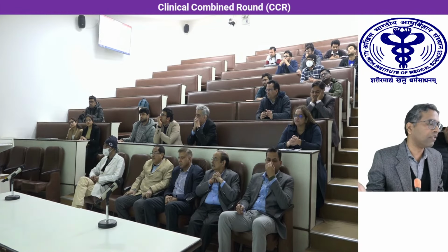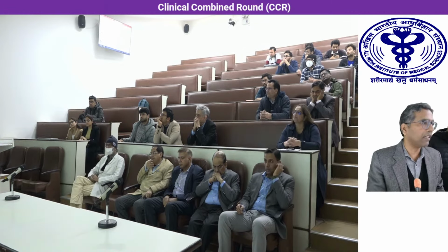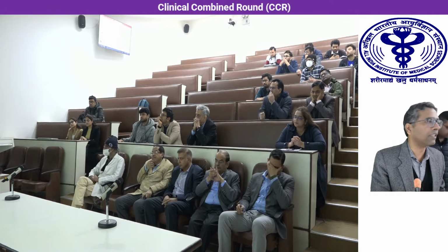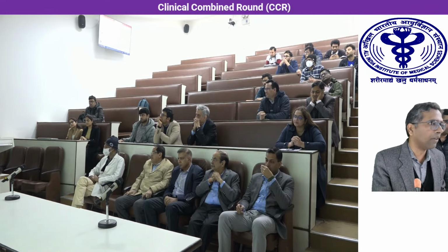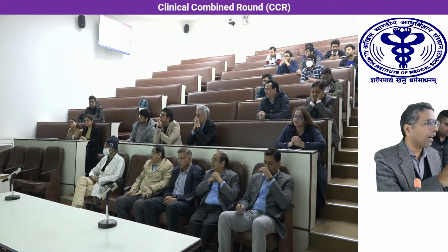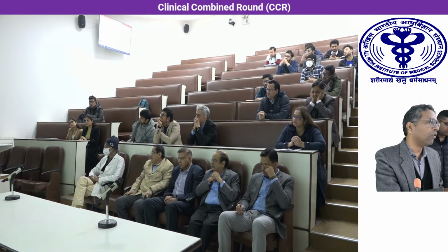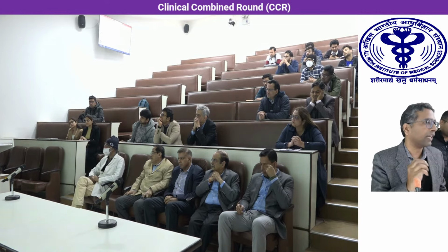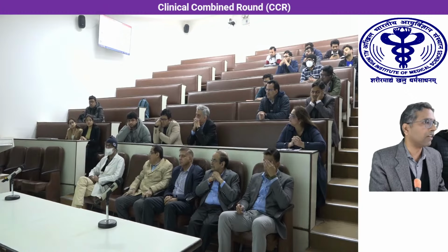If it is a smaller lesion with submucosal invasion, then ESD is usually not possible. Then we can apply this new technique, endoscopic full thickness resection. This is a very easy device, but it is costly, around 1.5 lakh rupees. But it can be easily done, and R0 resection is very good, and en bloc resection that includes the muscle layer can be taken out. So R0 resection and depth of invasion can be assessed.